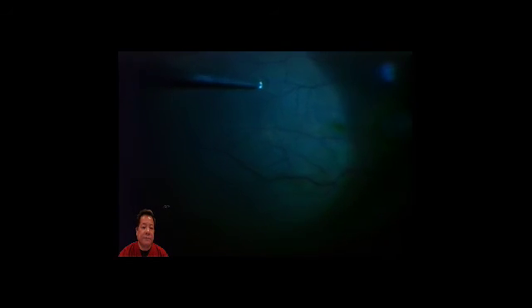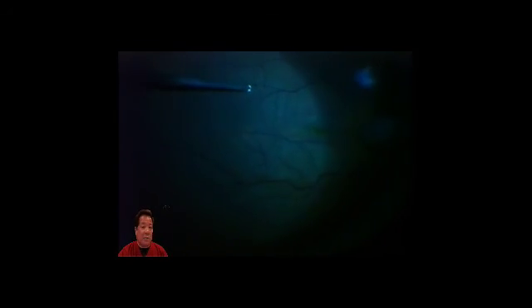So in just a few seconds, you'll see some of this darkly stained material being lifted off. And I think you just saw some there near the optic nerve. Sometimes this comes off very easily in one piece, and sometimes it comes off in lots of little pieces. We're just about at the end of the case.